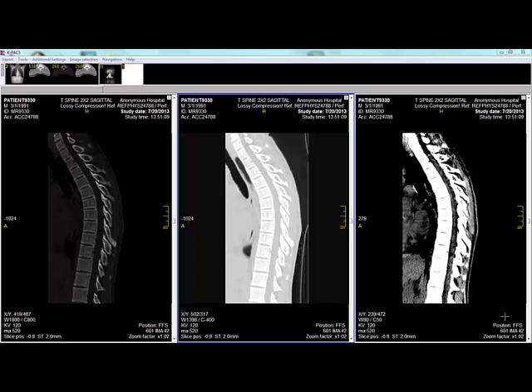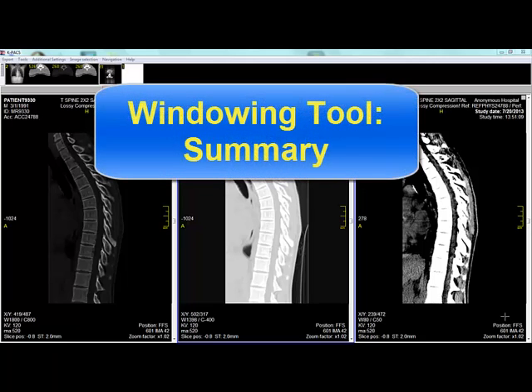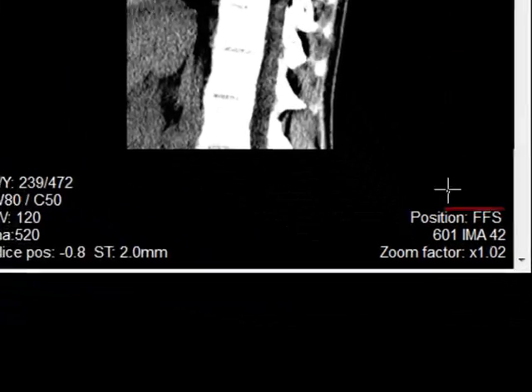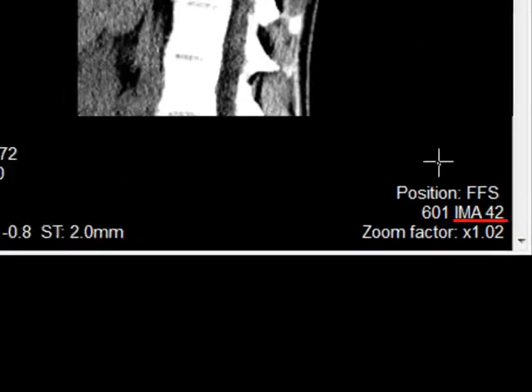In this tutorial we will show you how to use the windowing tool. We will start by summarizing what is found in this tutorial. What you are looking at are the three same sagittal sections from the CT study that Dr. Kim was asked to evaluate for back pain. You are looking at section number 42.